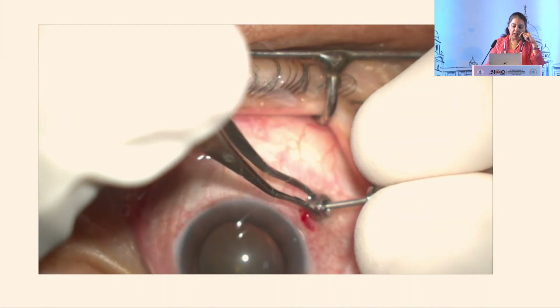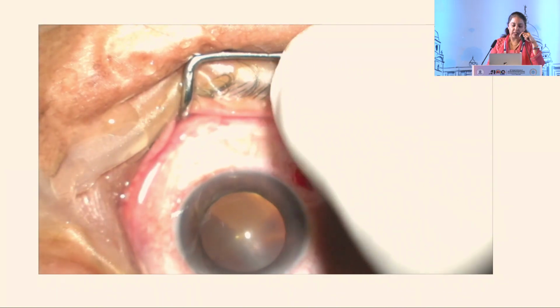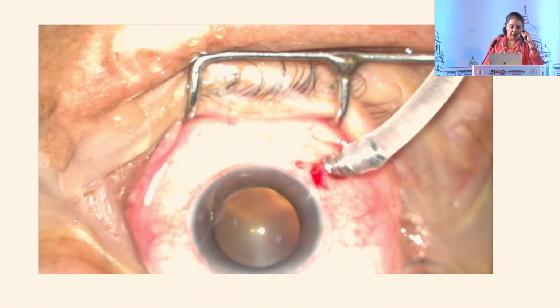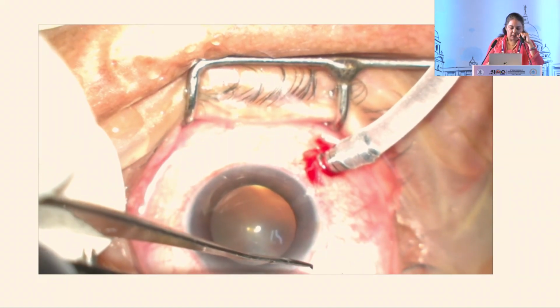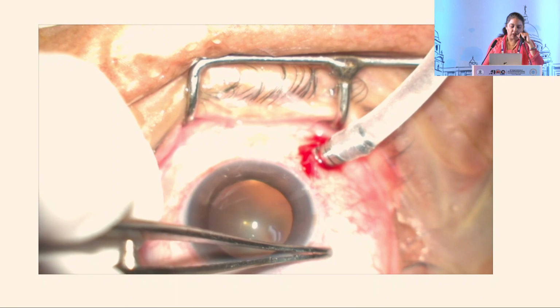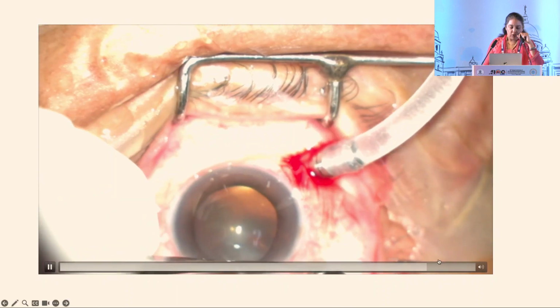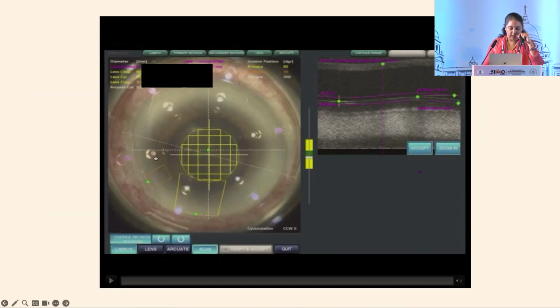When you feel that there is a pre-operative risk factor, it's obviously easier to place these before the surgery when you have an intact globe. This is the infusion. You can always plug it at the other side and use the vitrector as and when needed. Right? So with the modern instrumentation, using the pars plana approach has become easier.